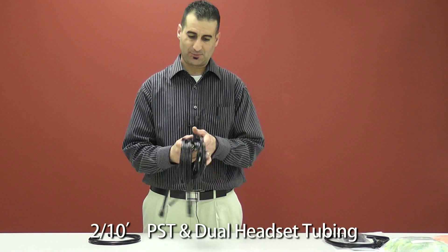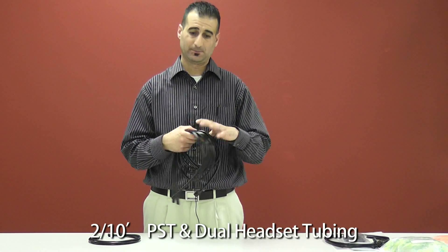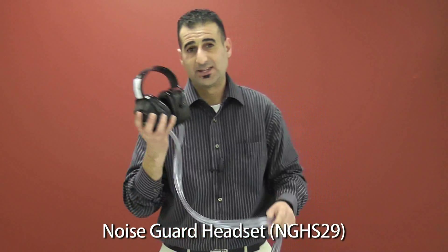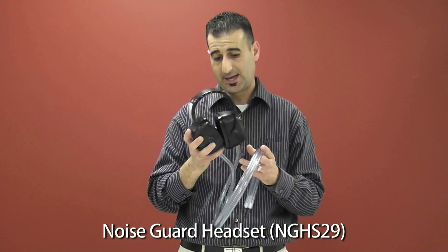Next is our sound tubing. You will be supplied two sets of 10 foot tubing along with the dual adapter headset, and one NGHS29 over the ear headset.